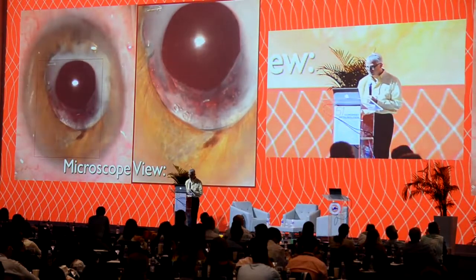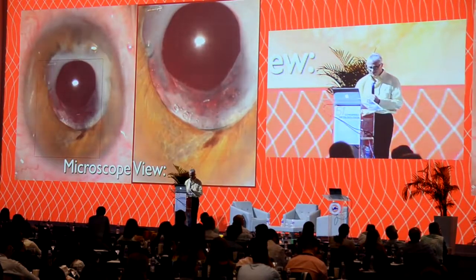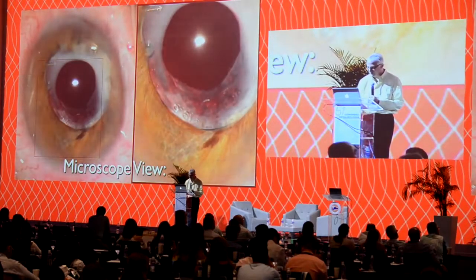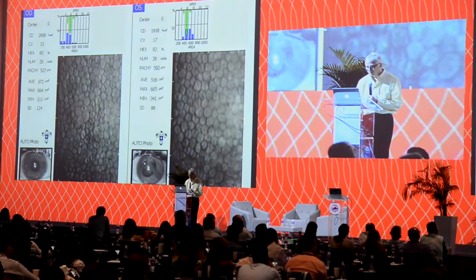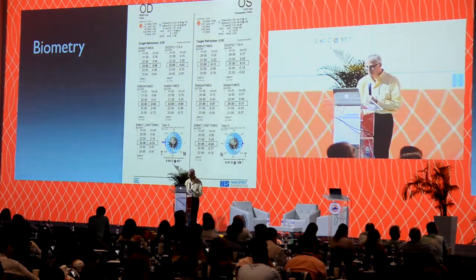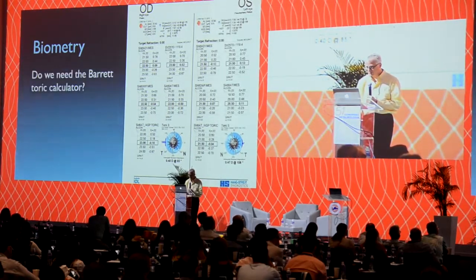And we know what the power of the implant lens is, right? It's a 19.5. We know that because it's actually stamped on the lens. Isn't that kind of cool? We don't see that much anymore. So it makes it easy to figure out what the refractive outcome should be. She's actually got decent endothelium, and here's what her calculations come out to as well, which correlate with what her refraction was and what the implant lens showed us.